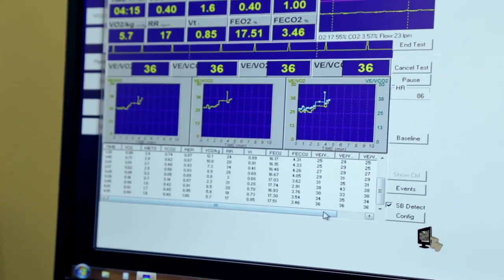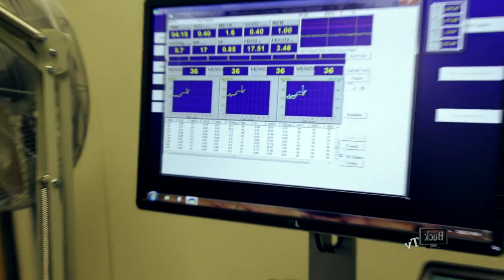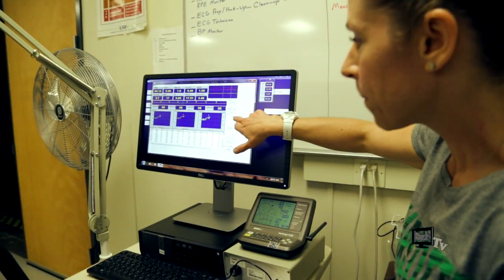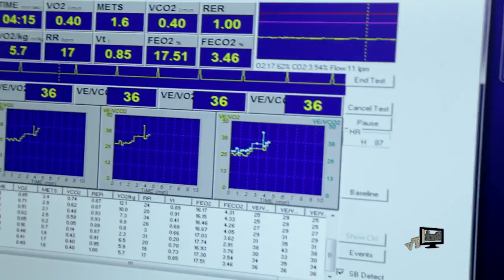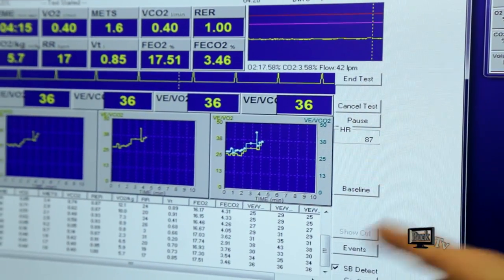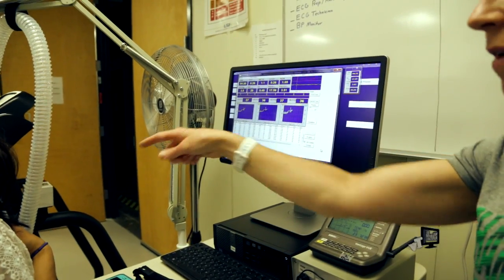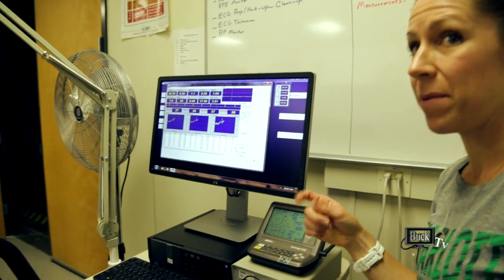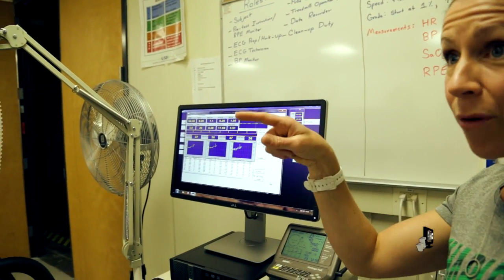I don't think it'll give us more room in that window. It seems funny to have all this wasted space. But we do know his heart rate's picking up, and I also put a Polar watch on the handrail as a backup, a little sensor right beside Valerie that's picking up his heart rate. If that stopped working, we'd have a backup and somebody writing it down, because heart rate's definitely something we want to know for his training program.